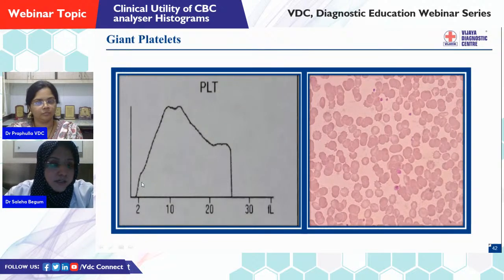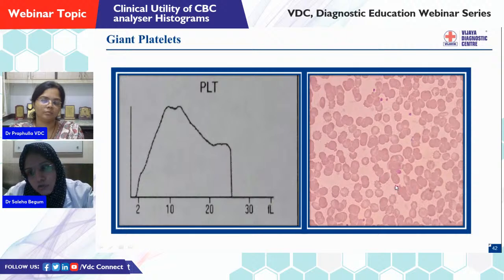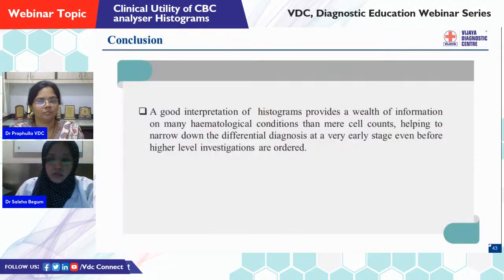This is another platelet histogram, very irregular, but to start with it is starting at the baseline, a very irregular curve with maybe a dip in the peak, and again not coming to the baseline at all, instead ending higher up. Upon seeing the smear, we can make out giant to large platelets in this patient's blood. So whenever you see such a platelet graph, you have to think of larger size platelets. So that's a good interpretation.